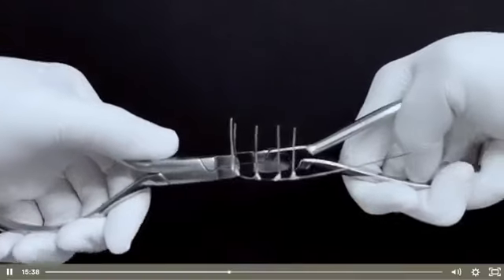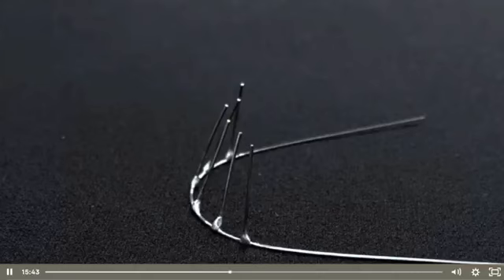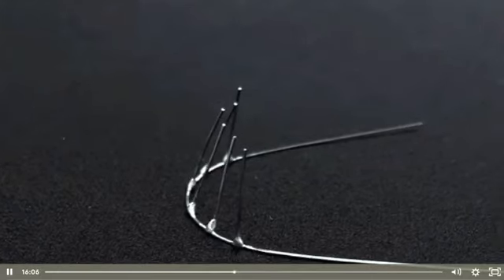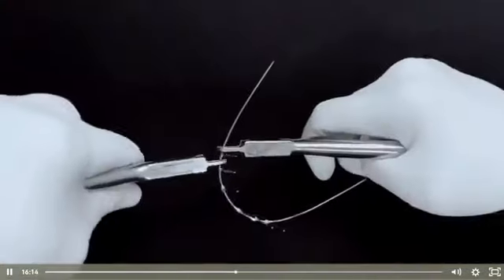And let me go again to this point here. Look at this. We have the canines perpendicular to the horizontal plane, and the anterior segment is showing inclination of the roots towards the palatal side. So a negative inclination of the root, which means that we are giving a positive inclination of the crowns. And the canines have zero angulation. They are completely perpendicular to the horizontal plane, perpendicular to the wire. So no inclination. And now we are applying the other way.